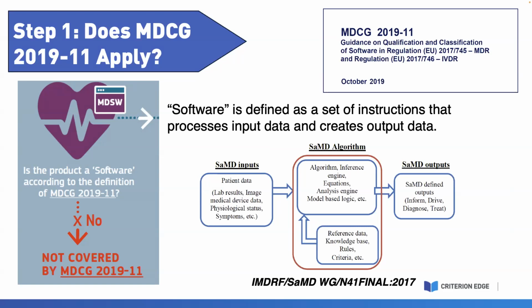So next slide. So suppose you have now, you fall under that definition, and your answer to the question is yes, I do fall under the definition. In step 2, this is where you ask yourself, is the software a medical device, Annex 16 device, or an accessory. And so in that case, you're asking yourself, is the software driving or influencing the use of a hardware medical device that may be qualified as an accessory?